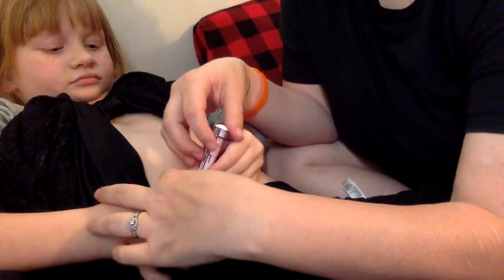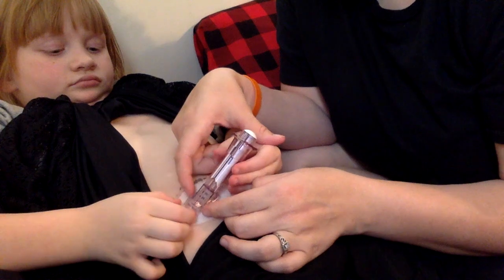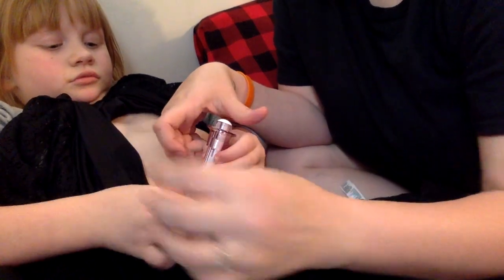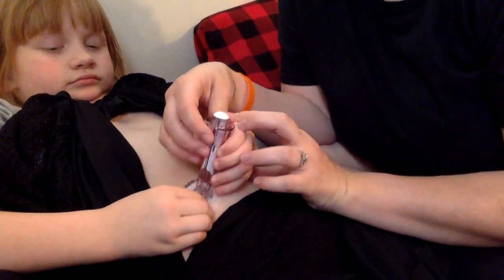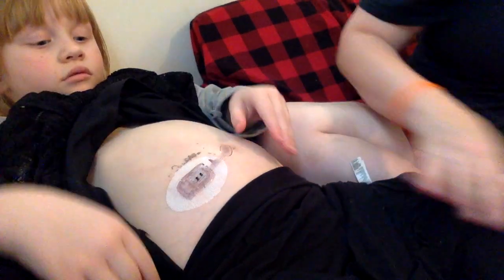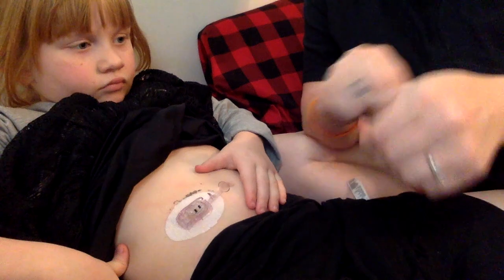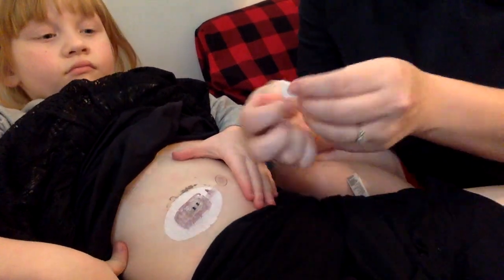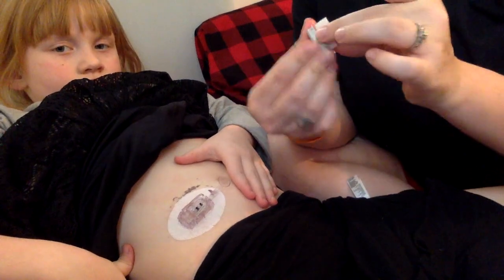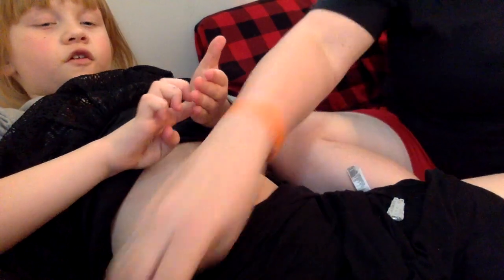Now what you're going to do, hold on, Sophie. Wait, move your fingers. On either side of the plunger right here, there's the little squeezy things that I showed you. You're going to squeeze those in, and then rock this piece out just like that. I just had to pull it. I know. Okay, now what you want to do is take another alcohol swipe and clean the back of the transmitter from where it was in before. Because if you don't, it will have a little bit of wetness on it.